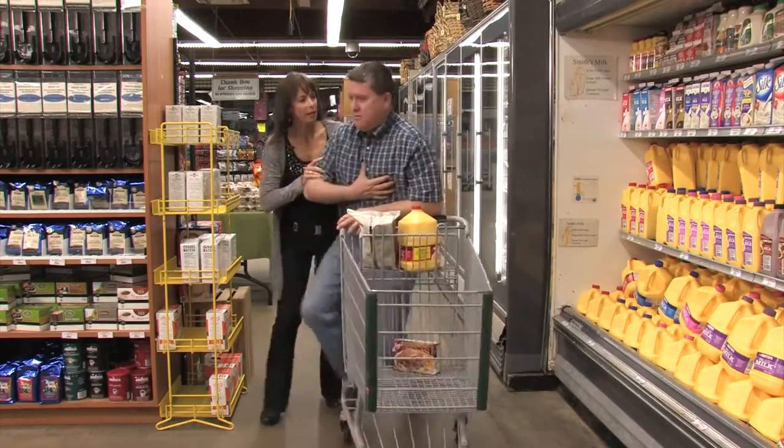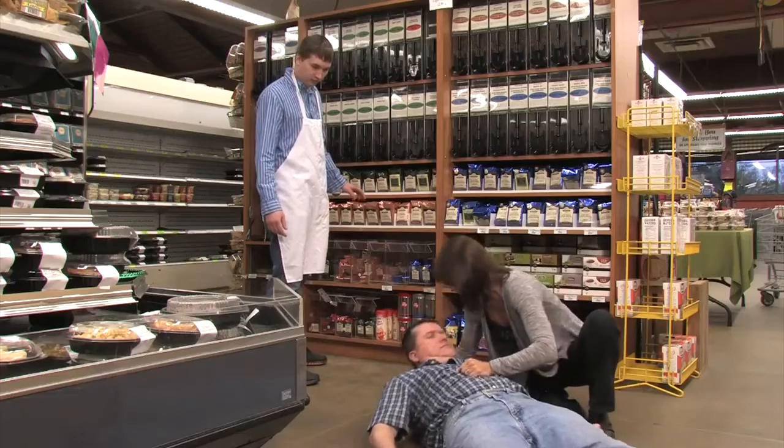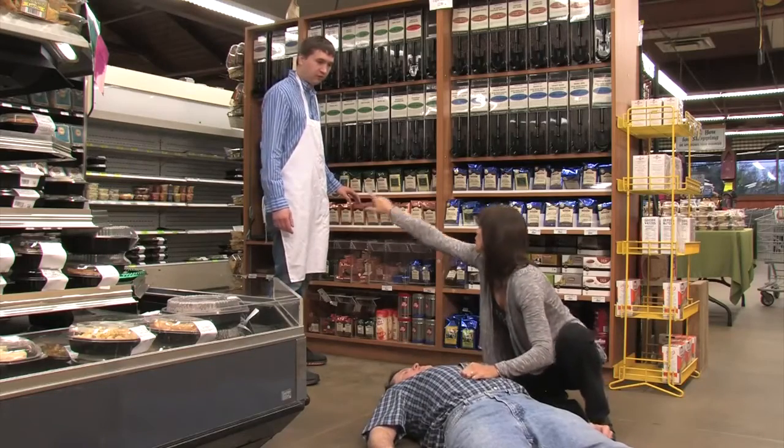Are you alright? Get the Samaritan PAD as quickly as possible. Go call 911. Go get the AED.